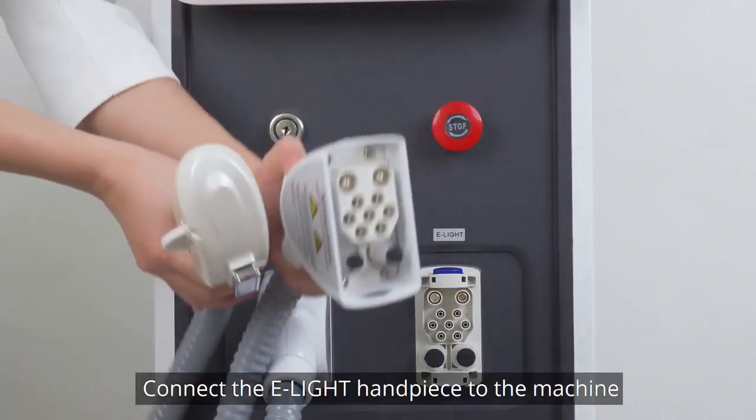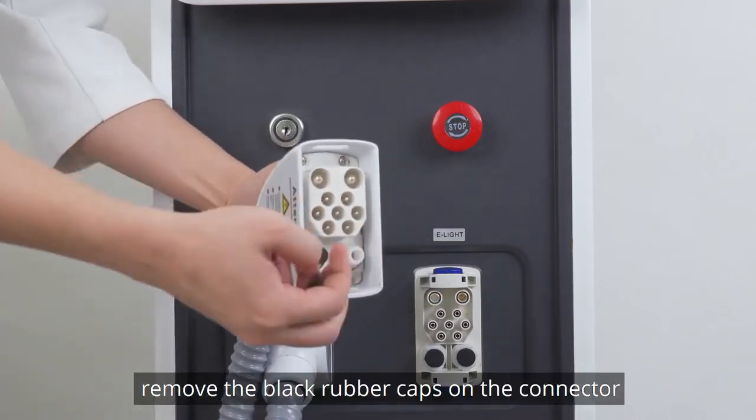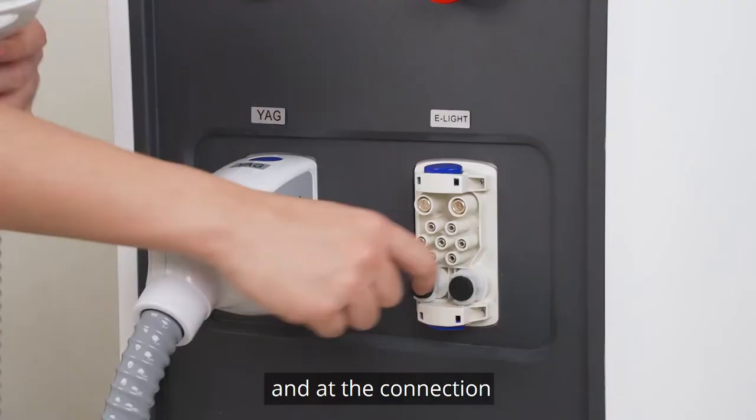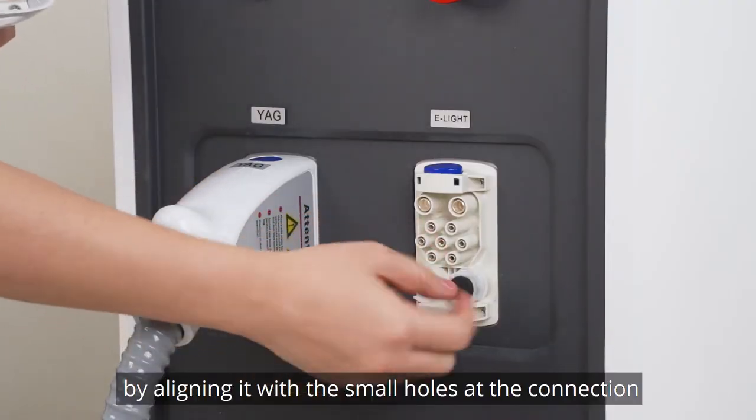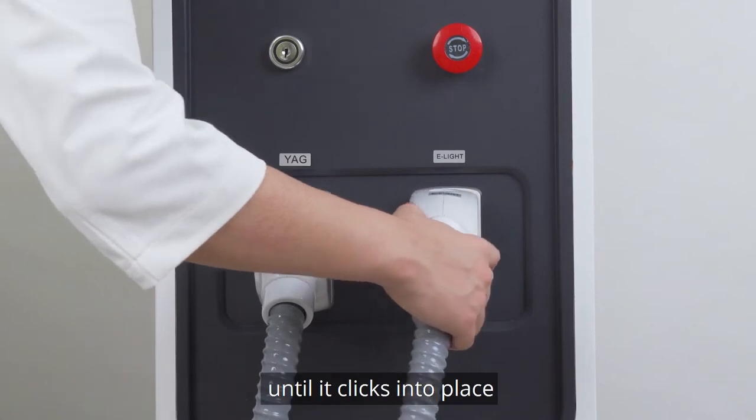Connect the ELITE handpiece to the machine. Remove the black rubber caps on the connector and add the connection. Insert the connector aligned with the small holes and add the connection until it clicks into place.